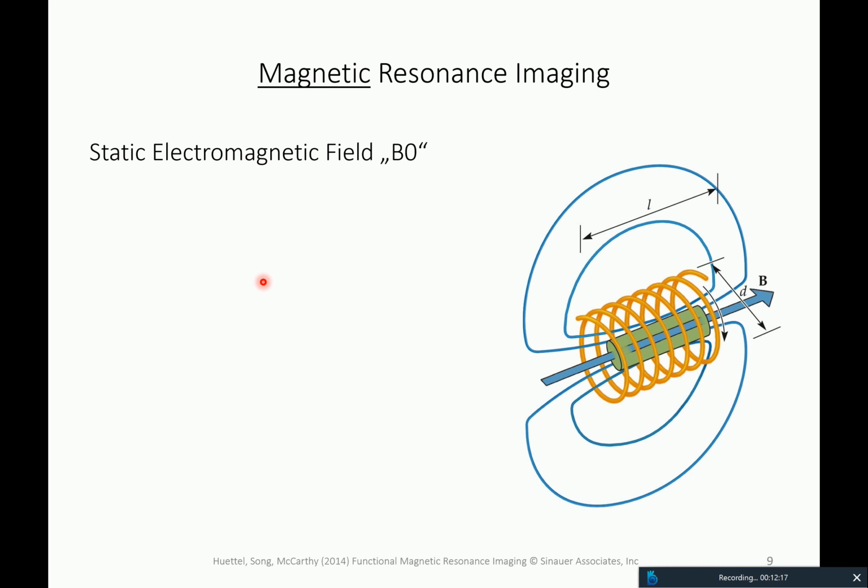The magnetic part, a little bit more on this. There is the static magnetic field, which is created by the scanner, and which you can actually detect if you go into this room. It actually draws magnetic things onto it. It is referred to as B0. So that's just a term you can learn about. This magnetic field is created by an electromagnet.